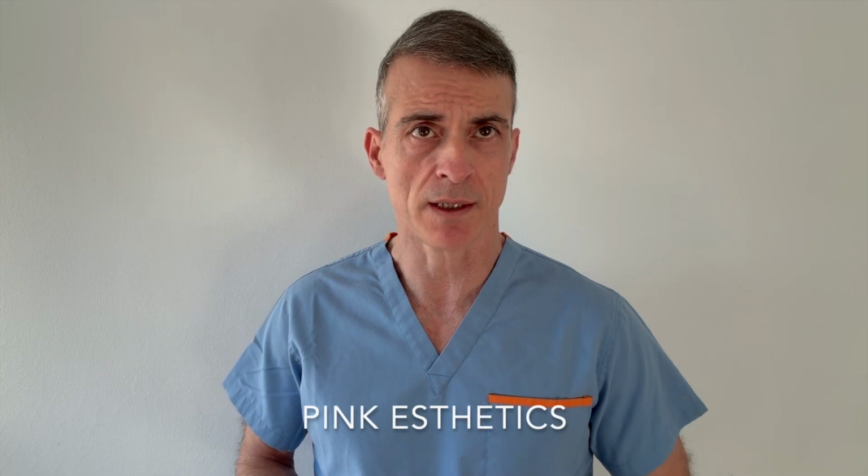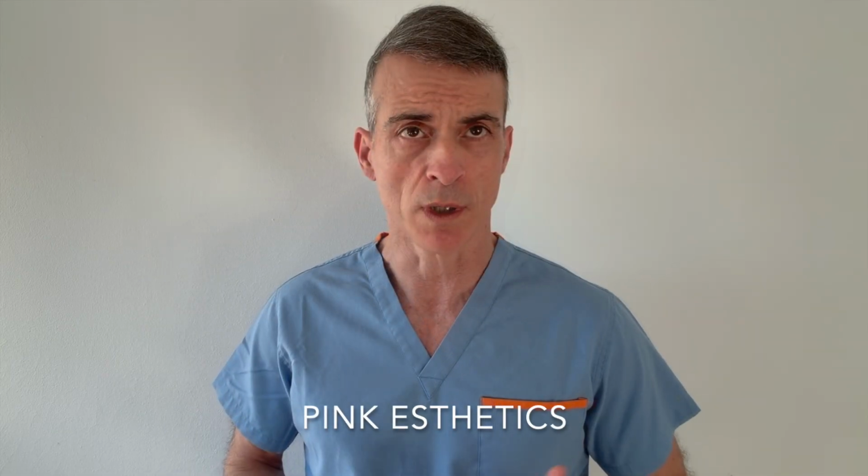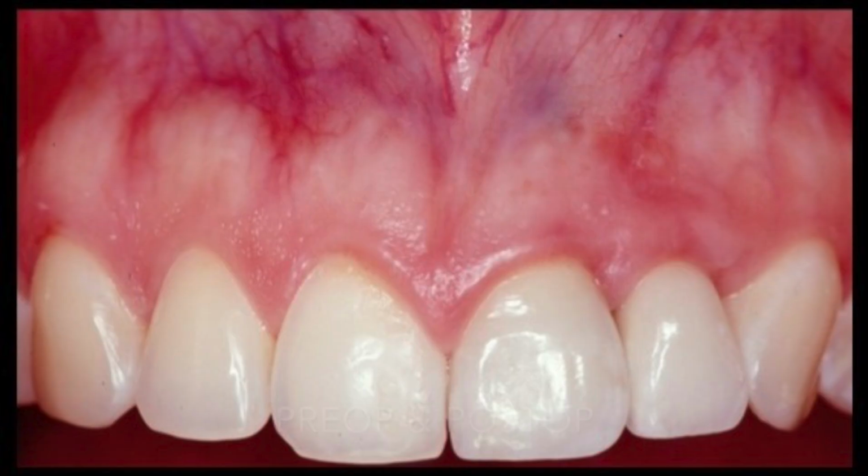Implant provisional restorations are a critical step to achieve optimal aesthetics and ideal pink aesthetic scores, which will determine the final aesthetic outcome and will make our patients much happier. If you skip the implant provisional restorative phase, especially in the aesthetic zone, there is a good chance your patients will complain and you will never get an ideal and symmetrical aesthetic outcome. The areas that will benefit the most from an implant provisional restoration are those in the aesthetic zone, in the anterior maxilla and mandible, especially for single units.